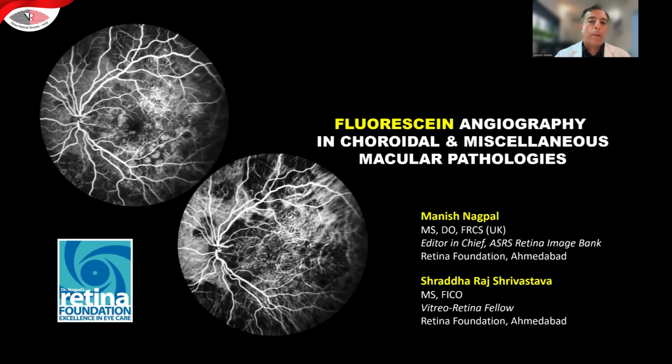Hello, everyone. Welcome to the next segment in Fluorescein Angiography. We've looked at some of its aspects in the previous series, and now we look at Fluorescein Angiography and its role in choroidal, RPE, deeper pathologies, and of course, a lot of miscellaneous macular pathologies.